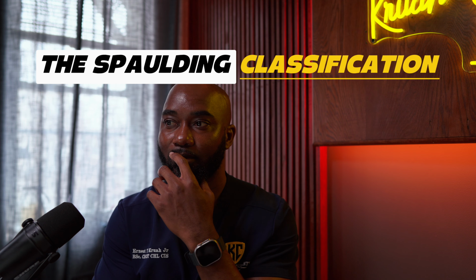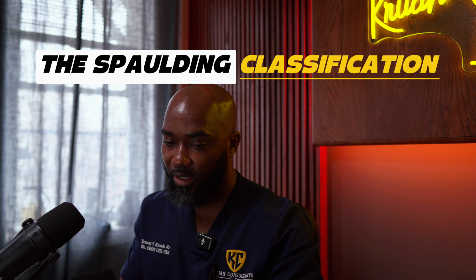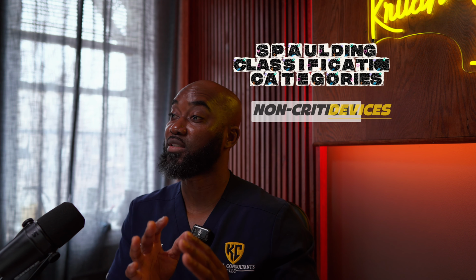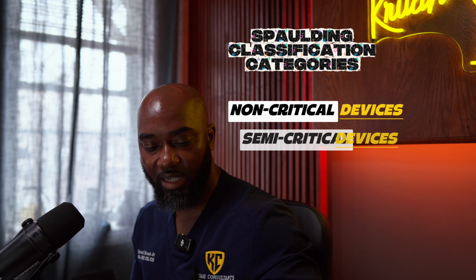When we classify surgical instrumentation based on the infection risk posed to a patient, if we use a medical instrument, what is it called? And how many categories are there within that classification? There's no wrong answer. If you get it wrong, we correct the answer. The Spaulding classification. Who's there responding? Patricia. Now Patricia has answered the question. Can somebody else give me the categories of the Spaulding classification?